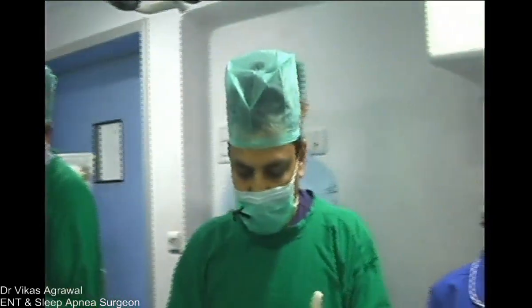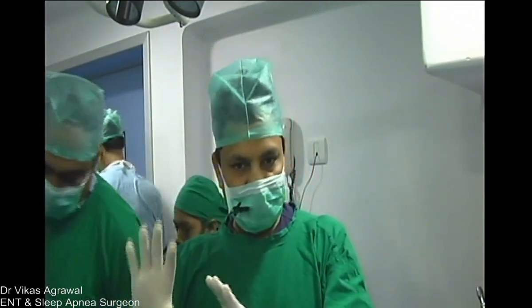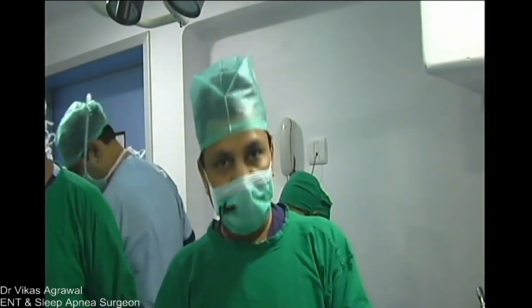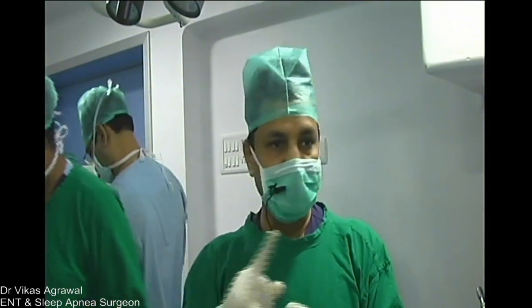So we are moving on to the septoplasty and turbinoplasty part. Sure. The next case we have is a palate and tongue base, so we'll again discuss the palate and tongue base. Perfect. Now the nose is equally important for obstructive sleep apnea. Absolutely. And what we have to understand is the flow of air.